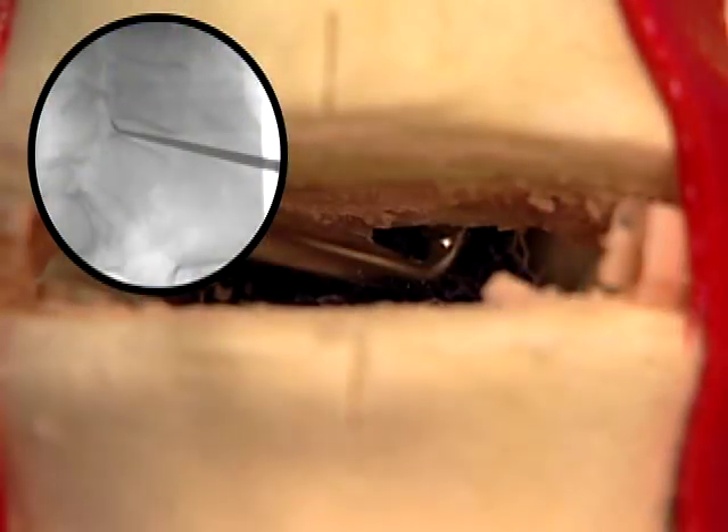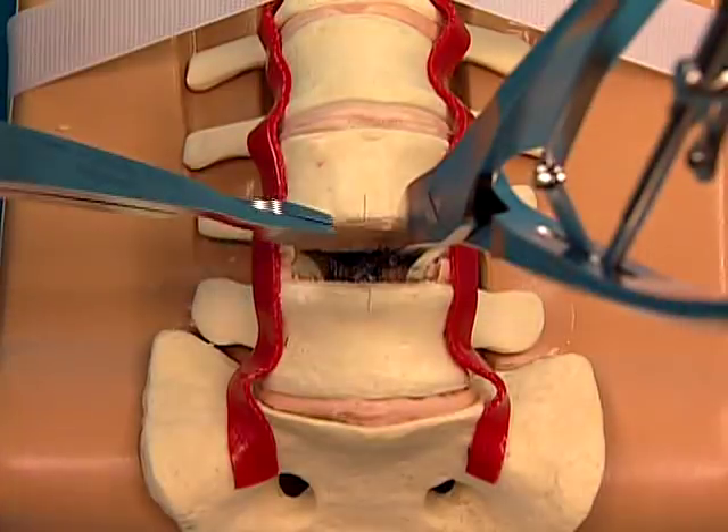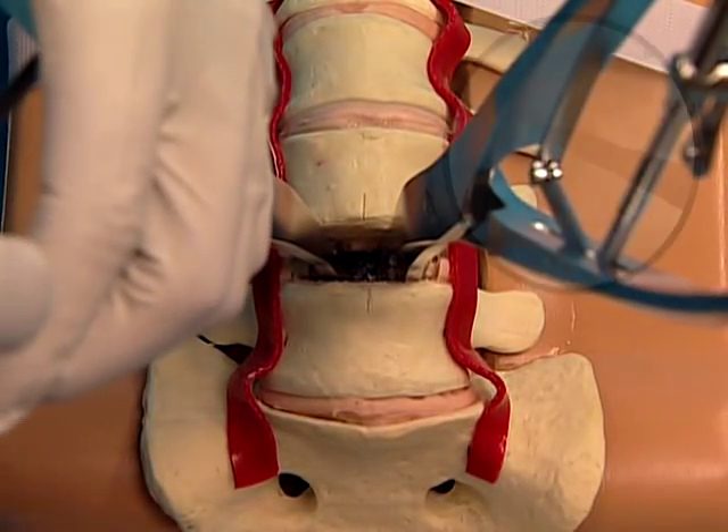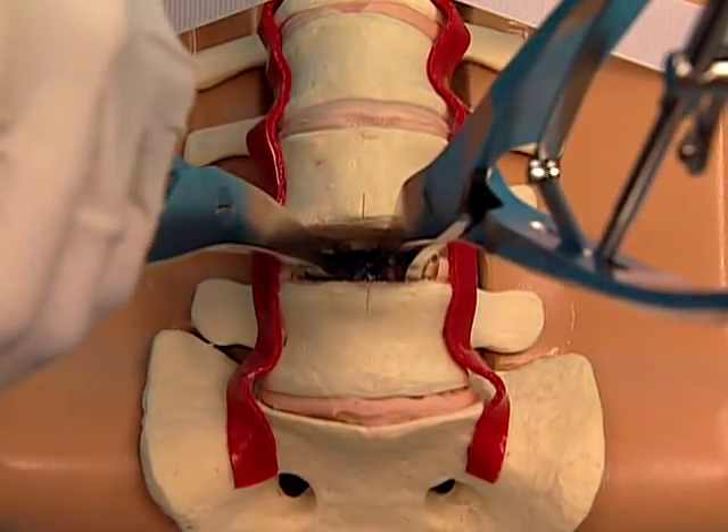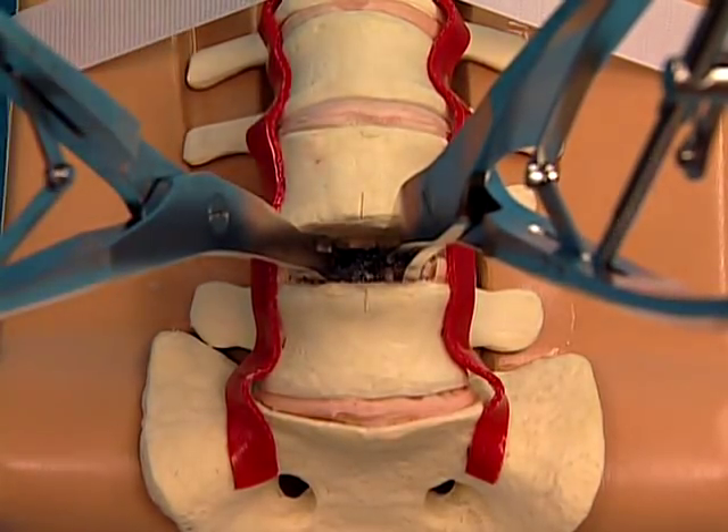Release the posterior longitudinal ligament by scraping a curved curette along the posterior border of the vertebral bodies. If posterior remobilization cannot be achieved after the posterior longitudinal ligament has been released, the posterior longitudinal ligament may be transected or completely resected. Use a vertebral body spreader on each side of the disc space and distract to ensure that the remobilization is balanced.